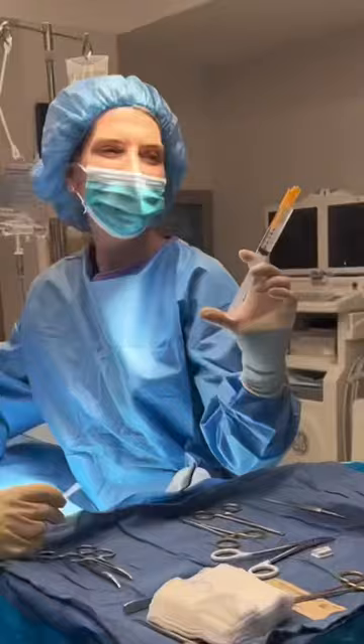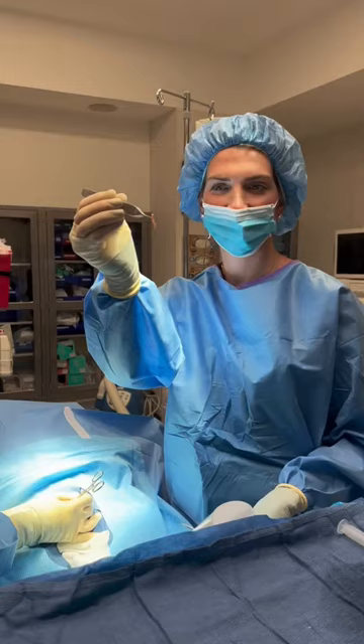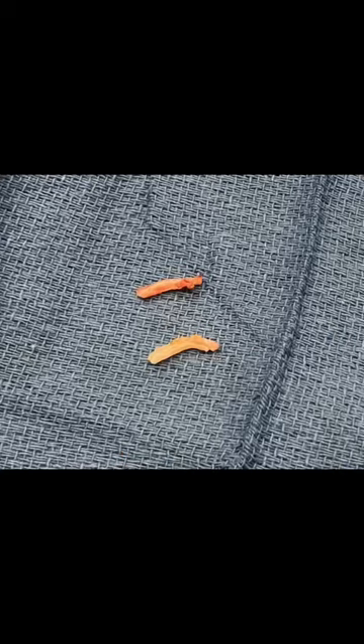I'm going to numb the area. I make a tiny little window in the scrotum with this sharp instrument and then I pull the vas up with this ring clamp. I skinny down the vas and then excise a one centimeter portion. We clamp and cauterize the ends so they can't find each other in the future.